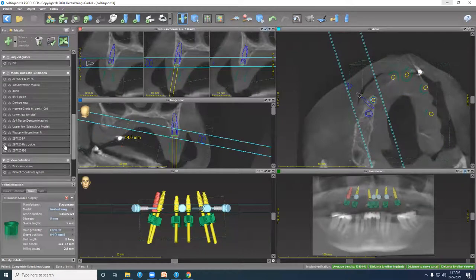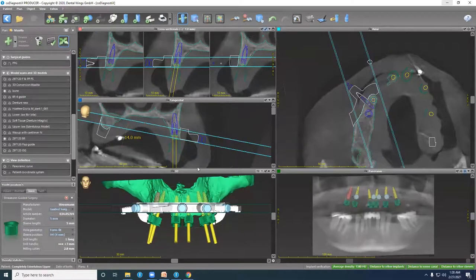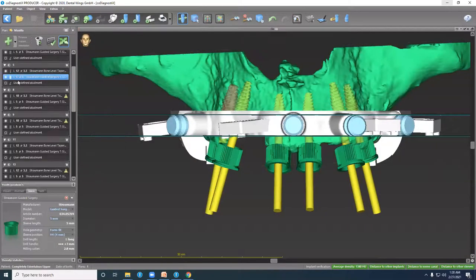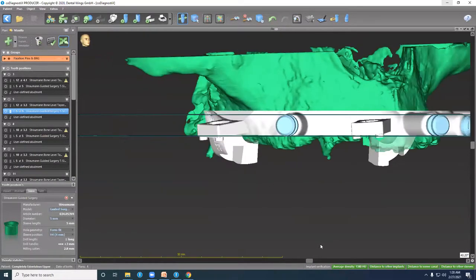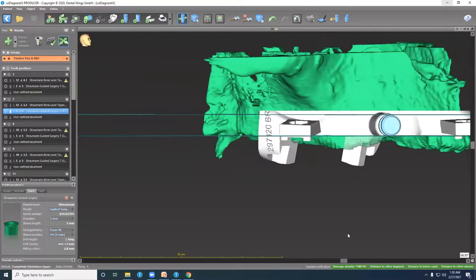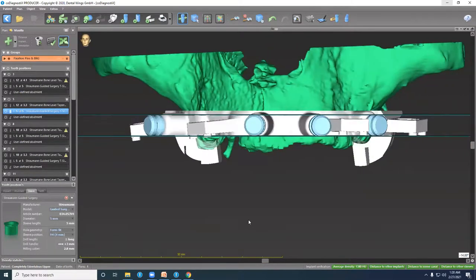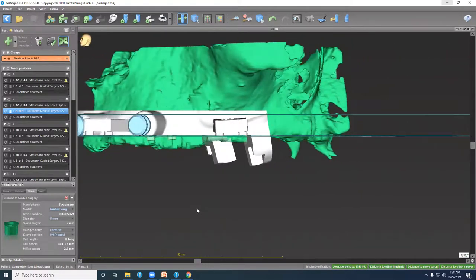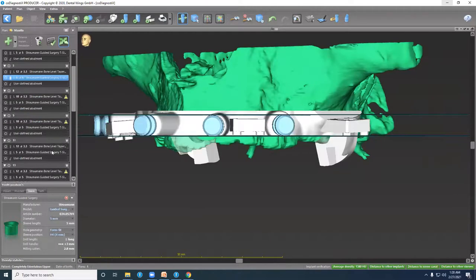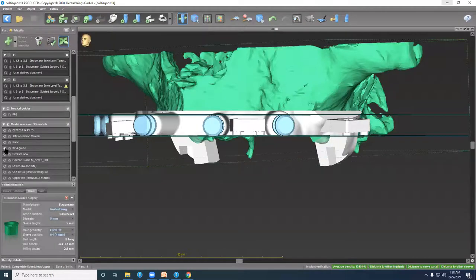Next comes in the bone reduction guide, and it seats on the existing bone level. We hide the implants. This is how much bone is sticking out of the reduction guide. So this amount of bone will be leveled, again, guided by this reduction guide. You should level it to the level of plastic. And after this bone is gone, you'll be left with something that looks like that.